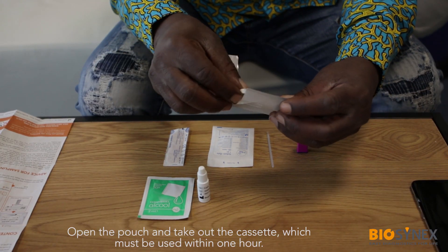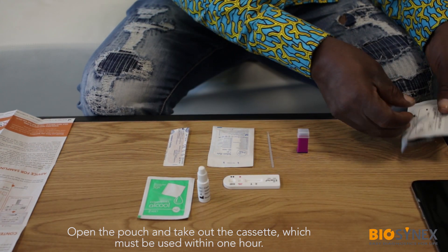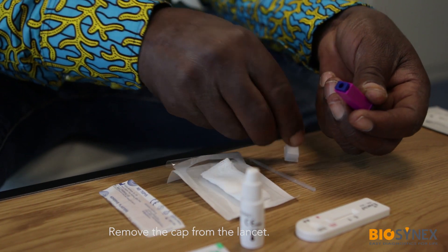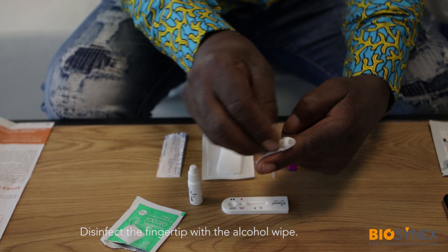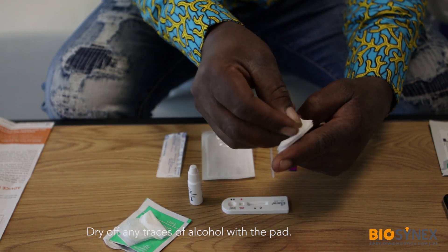Open the pouch and take out the cassette. This must be used within 1 hour after opening. Take the wipe and the pad out of the packaging. Remove the cap from the lancet. Disinfect the fingertip with the alcohol wipe and dry off any traces of alcohol with the pad.